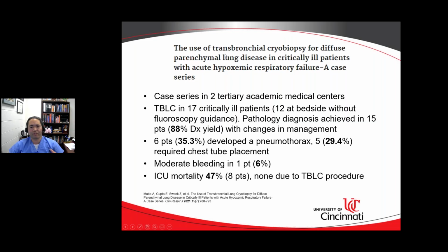Patients that are generally in the ICU have acute hypoxemic respiratory failure. They have bilateral pulmonary infiltrates, we just did antibiotics, we just did diuretics. They're still requiring a lot of oxygen, and we don't know exactly what's going on. So does it make sense to do a lung biopsy at that moment? This is a case series in 2 tertiary academic medical centers. Cryobiopsy was done in 17 patients, 12 at bedside without fluoroscopic guidance, and 5 in the procedural area.